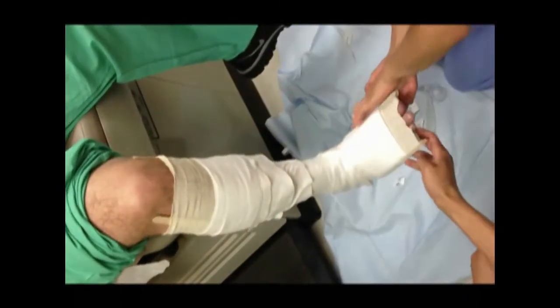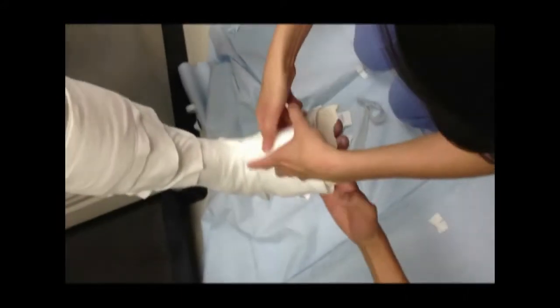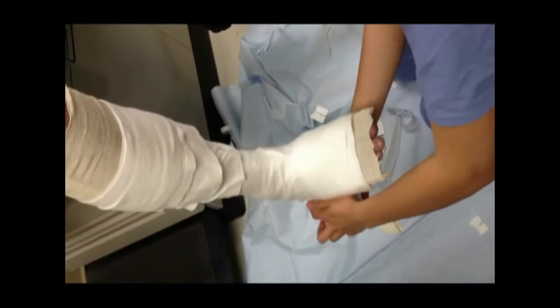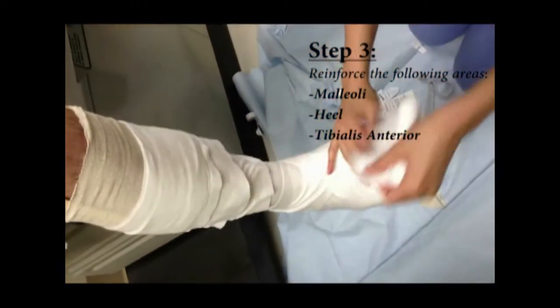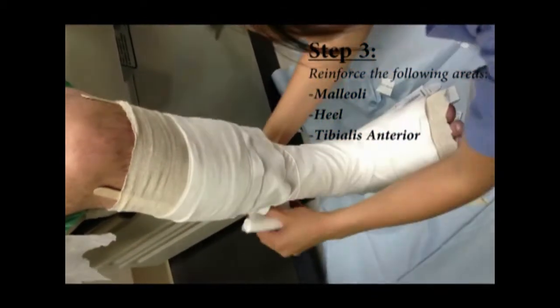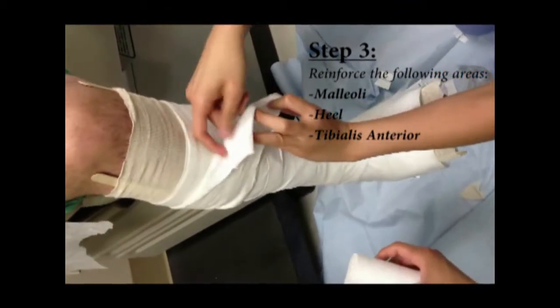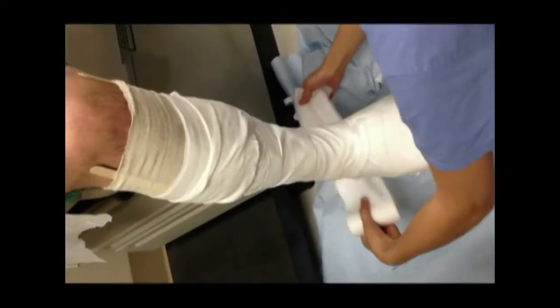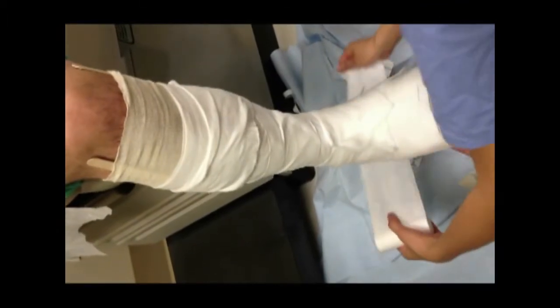Make sure the web roll comes down a little further on the plantar side, up to the sulcus. A lot of times it's easy to miss and not as far out. So you want that web roll to extend on the plantar aspect. There are a couple of areas where we want to give the patient some extra protection around the malleoli of the ankle and the heel. We reinforce the heel especially with people that we think might walk on it more than they should, so the cast doesn't break down.